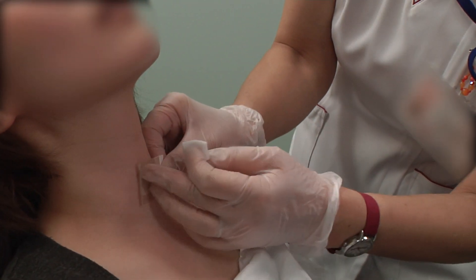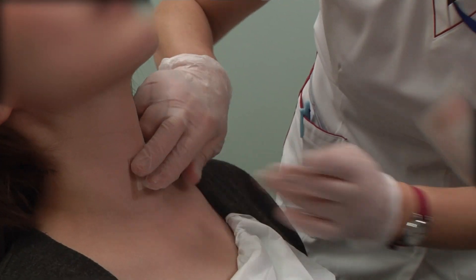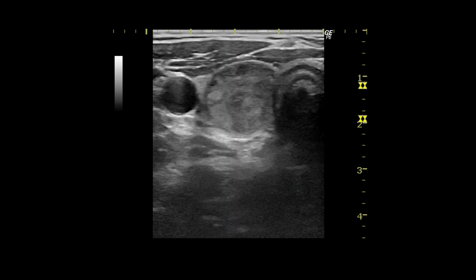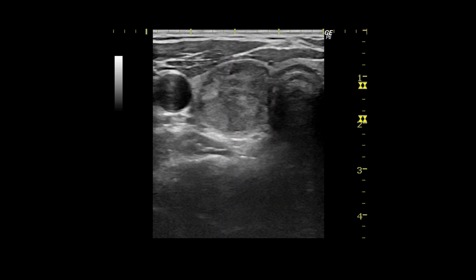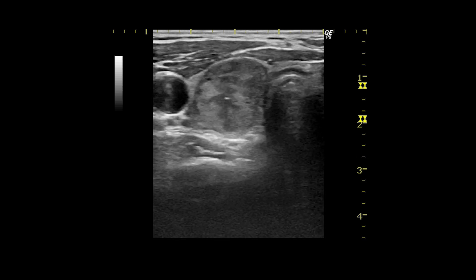After the piston movement, we release the pressure and extract the needle. Then, we apply a bandage on the explored area and press it. The sampling site is very important. We must identify the needle tip within the nodule and must not protrude it outside the nodule during the piston movement.